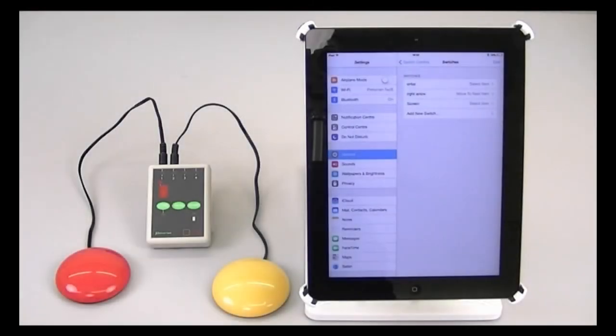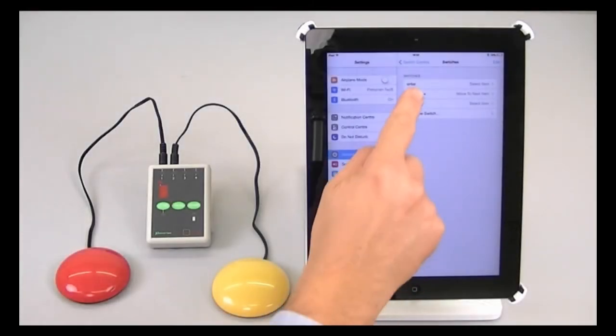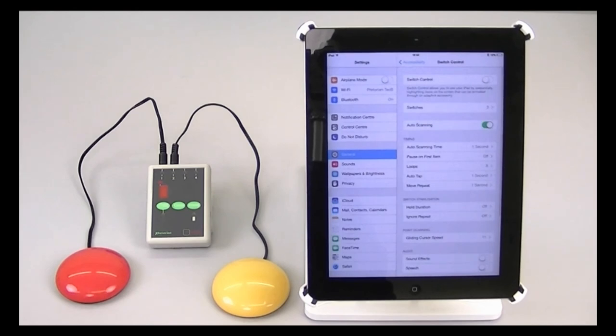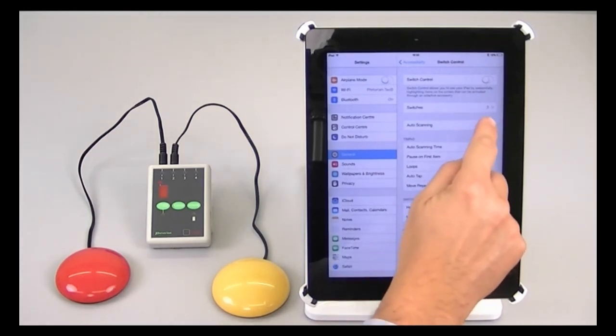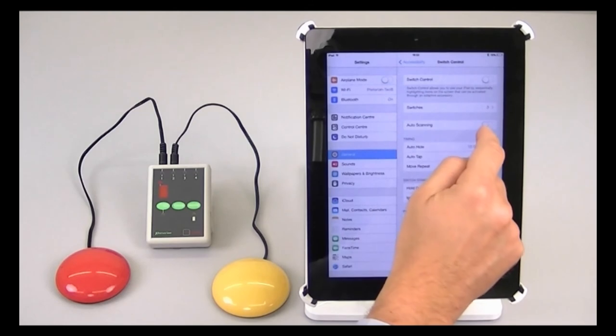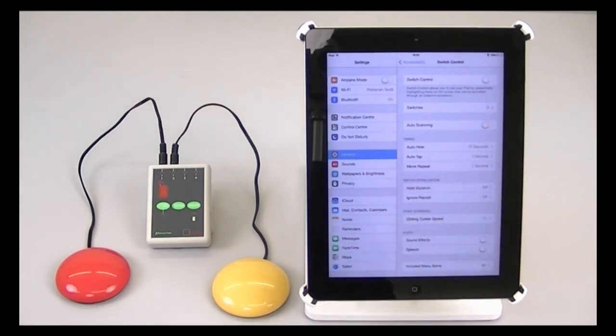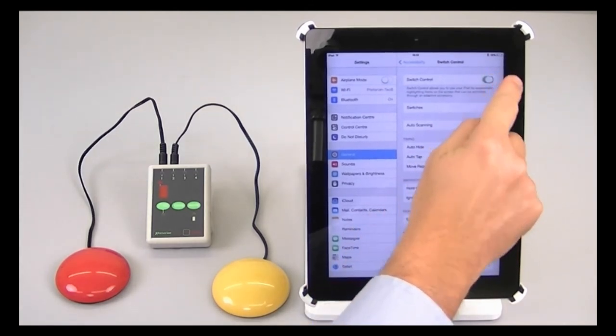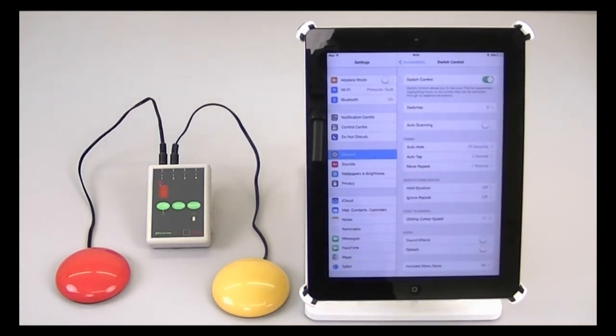Now that I've configured all my switches, what I'm going to do is go back to the switch control main menu, I'm going to turn off auto scanning, and I'm going to turn on switch control. So now switch control is on, but with manual scanning.